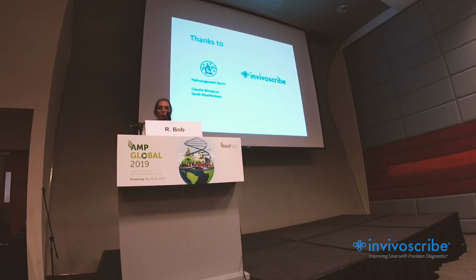And when the fragment analysis cannot help, then we send a sample to Invivoscribe for NGS analysis. So our first step is fragment analysis, but the reason is only economy, because the type of health insurance in Germany for patients who are publicly insured doesn't allow us to apply NGS for all of the cases. Otherwise, we would do it really.